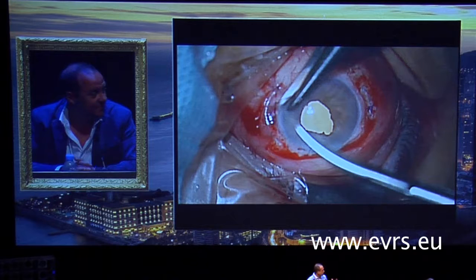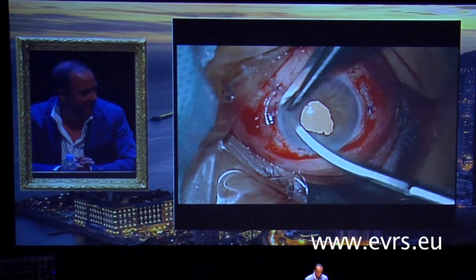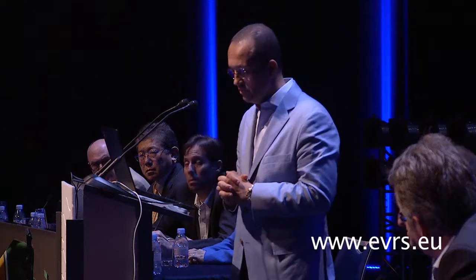Tom, have you tried any of those IOL fixation techniques? Yeah, I've tried several of those techniques, and it is frustrating to get those haptics to do what you want. One issue we had early on is we started making our sclerotunnels a little bit bigger to get the haptic through it, but then we found out a few months later that it was loose in there and caused some chronic irritation, some chronic scleritis for the patient. So we've made them smaller again, but then that introduces more problems with the bending.